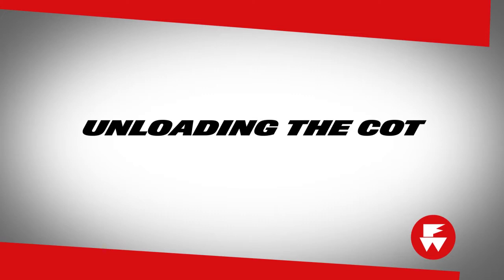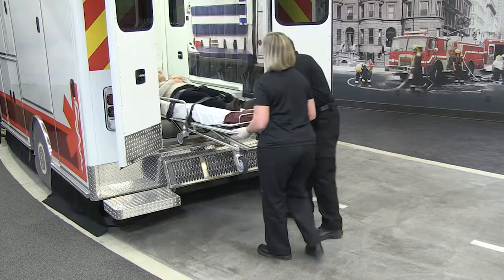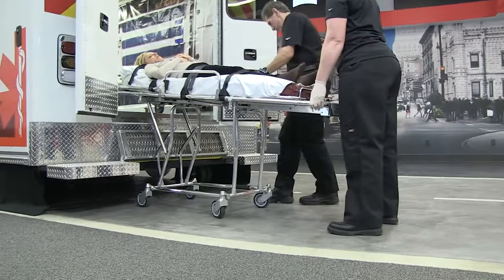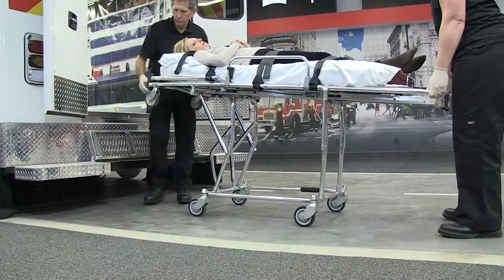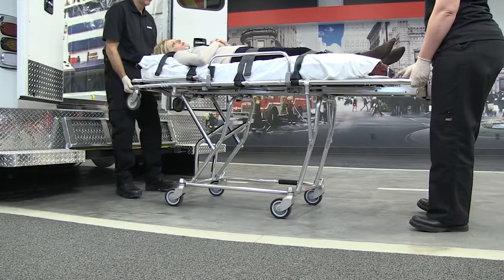To unload the cot from the ambulance, release it from the fastener. As the cot is pulled out of the ambulance, the undercarriage unfolds and locks. Lower the foot end until all four transport wheels are on the ground. The cot will be in the loading position. Pull the cot backward until the loading wheels just clear the patient compartment floor. Change the cot to the high-level, mid-level, or low-level position before rolling it away from the ambulance.